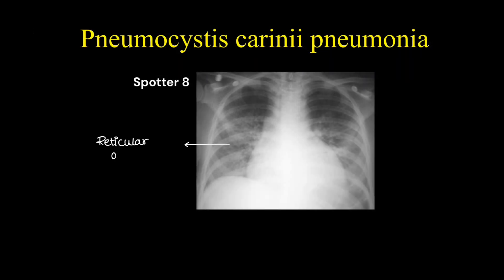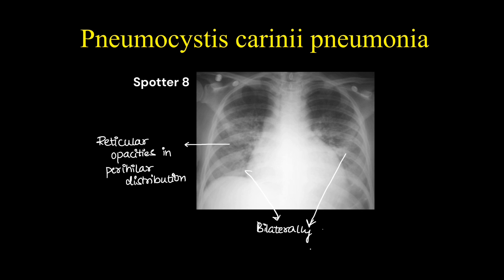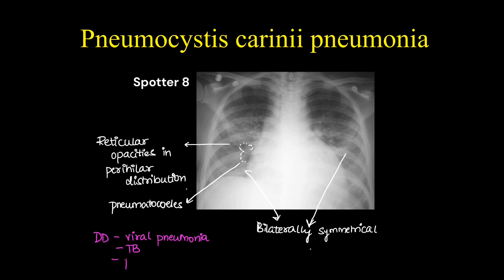On this chest x-ray we can see bilateral perihilar reticular opacities, which are symmetrical in nature. This is a case of Pneumocystis carinii pneumonia. There are pneumatoceles which point towards Pneumocystis carinii. Otherwise, the differential diagnoses include viral pneumonia, tuberculosis, or pulmonary edema.